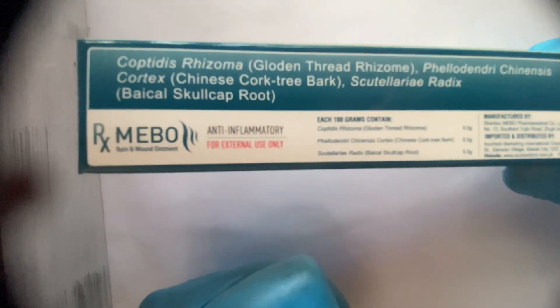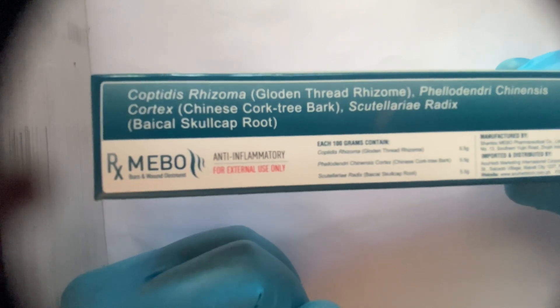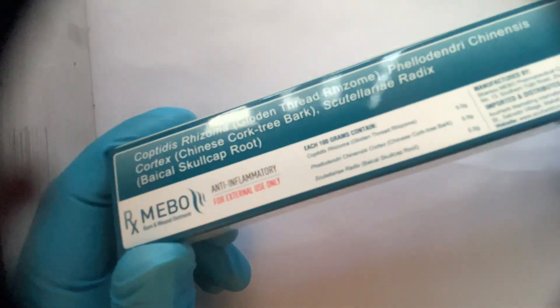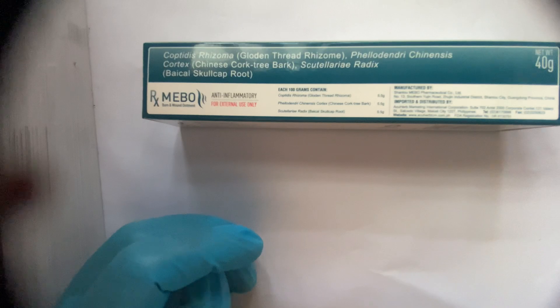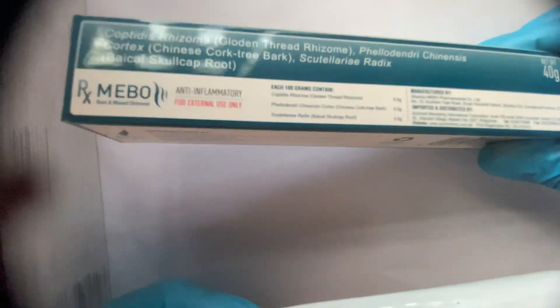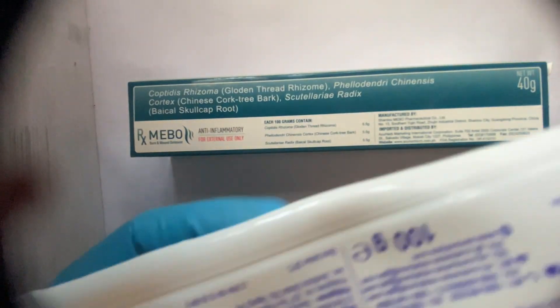I will show you step by step how you can do your own dressing at home. This is the box, and inside you get the MEBO tube — it is like a paste. I am not using the actual MEBO here because it is a little bit expensive, so I will show you a demo with another cream so you can see how to apply in a similar way.